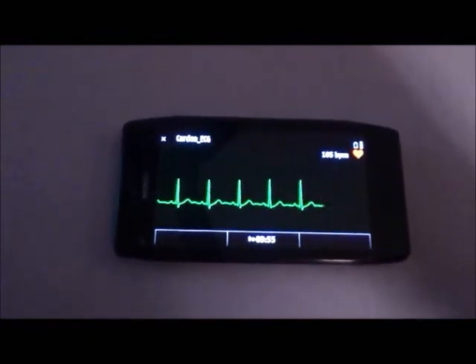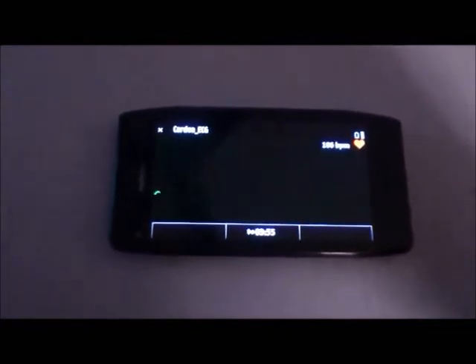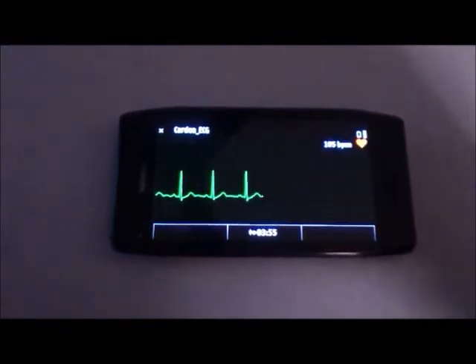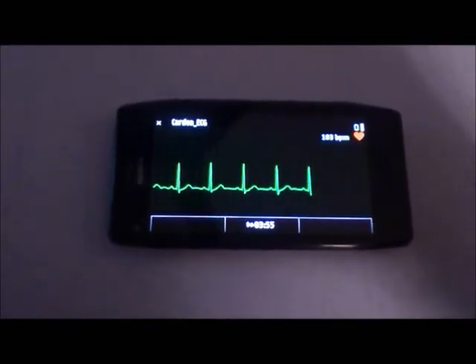At the top right, also getting displayed, is the patient's heart rate.